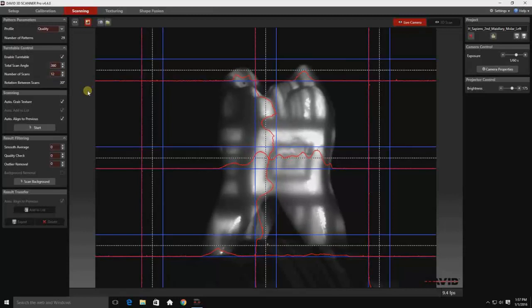When you're setting the number of scans, you may think that a higher number will yield better results. All a higher number will do is produce a lot of redundant information. The redundant information will result in a larger file size and make cleaning more difficult. I found through experience with working with these smaller objects that ultimately I only need about six images to create a model, but I typically need about 12 scans to give the computer enough information to align those individual scans together in the initial processing phase.